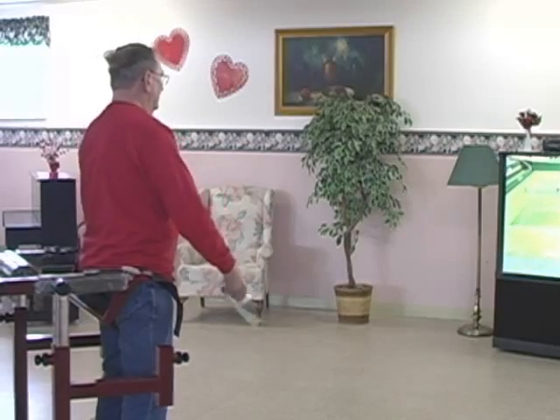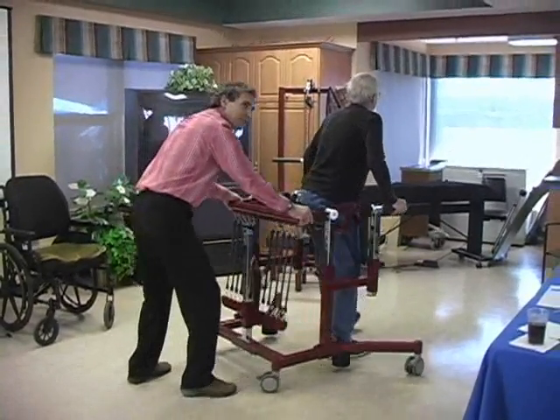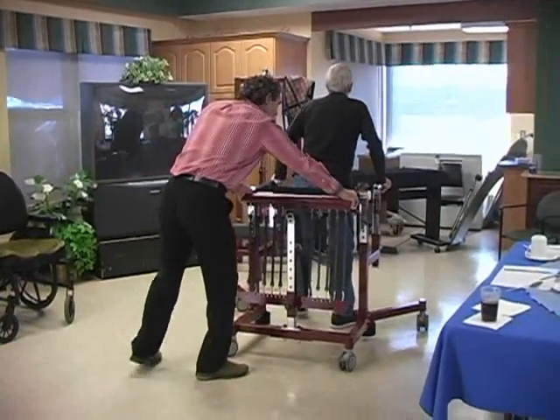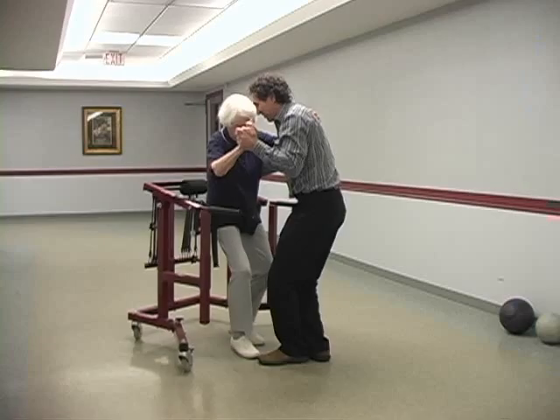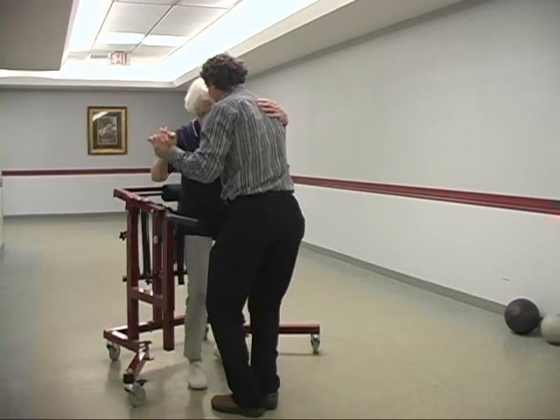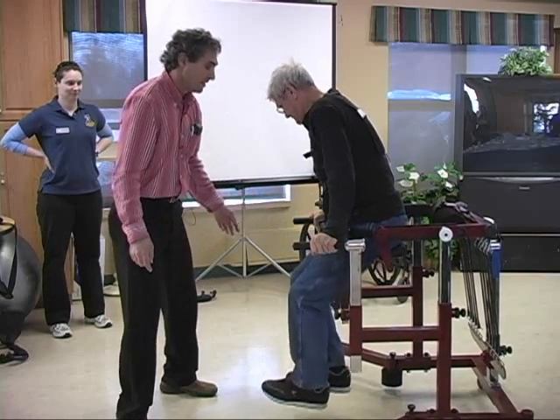The Bungie Mobility Trainer is an enabler of mobility that provides a safe, body weight supported environment for walking, running, playing, dancing and other activities which mold and improve the natural connections in the nervous system that govern stability.